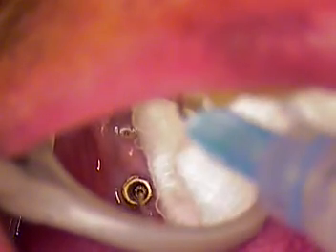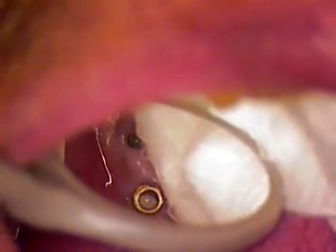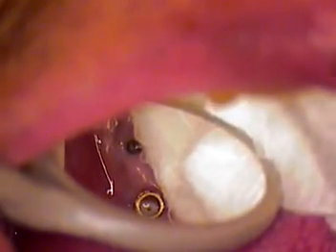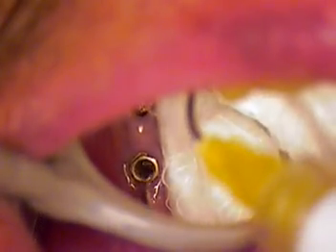Micro suction please. You can see the action already, how it's just going right after that tartar, and it's just bubbling up nicely.